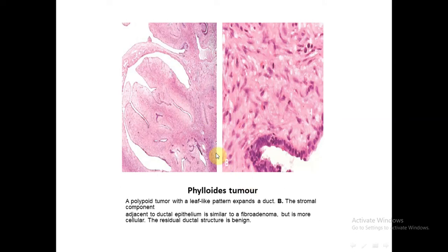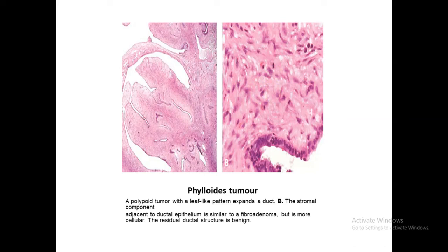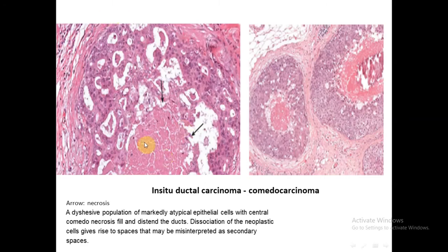This is the phyllodes tumor. It originates from the stroma of the breast and not from the epithelial part. It shows two components: the epithelial glands, which are the least dominant component, and the stromal mesenchymal or spindle cell component. Here we have a leaf-like appearance. The glands are benign, but the stroma is assessed on certain points to determine if this is benign, borderline, or malignant phyllodes tumor, depending on cellular features, presence of atypia, presence of mitosis, and presence of necrosis.